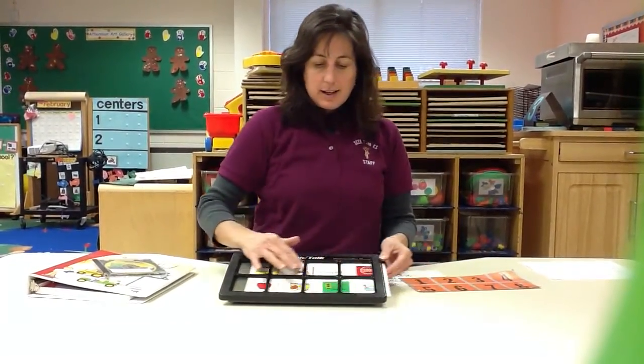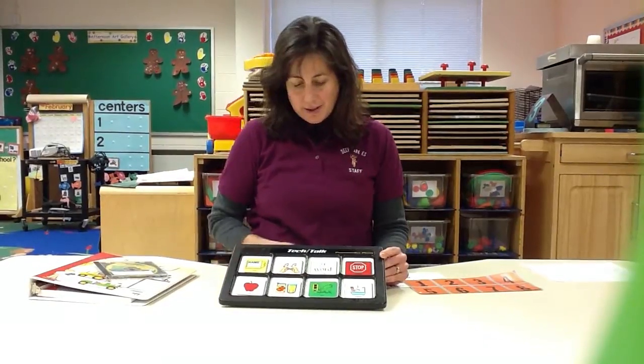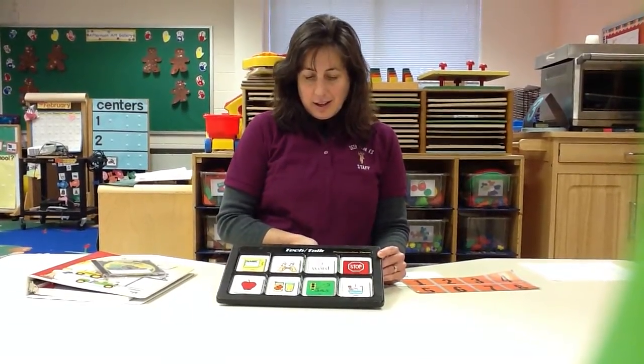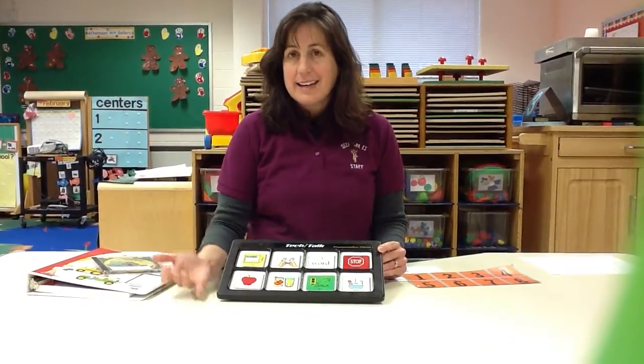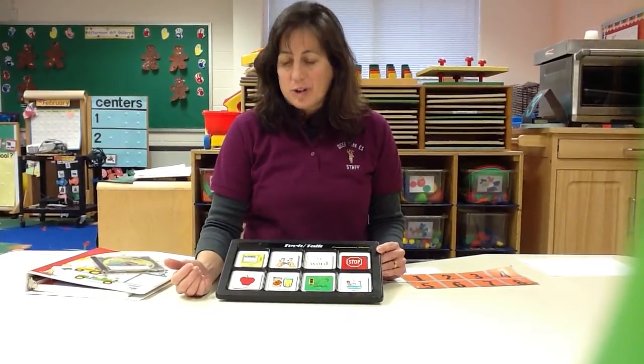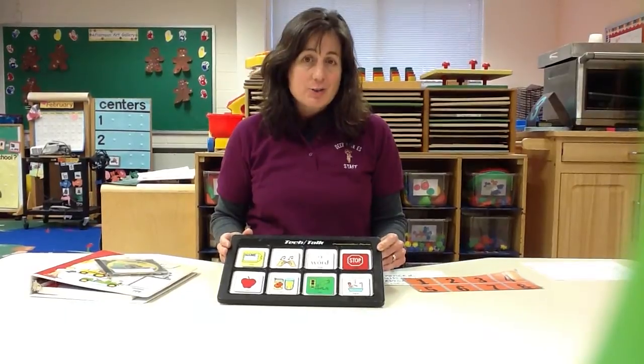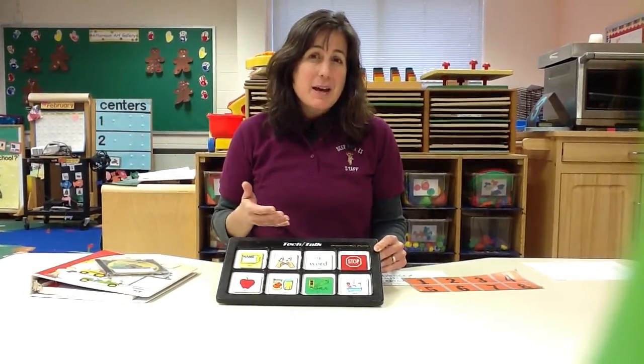So, let me show you. This is a board that is pretty common. It has a lot of functional words for a student to use. They can say things like eat, drink. It has real voice technology. So what you want to do with this is use a recorded voice, or get a student to record this voice that is of the same age and gender of the student who is going to use the board, so it really sounds like them.